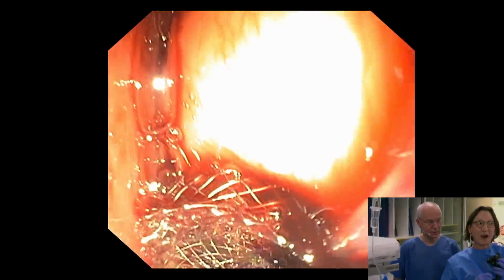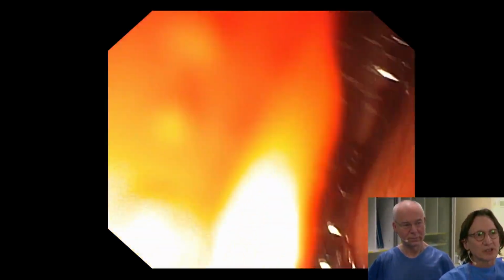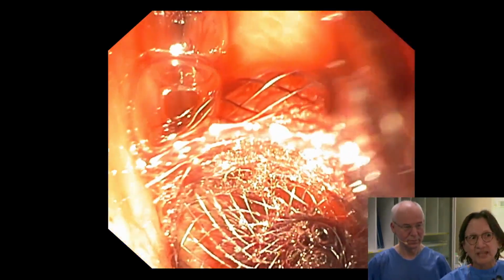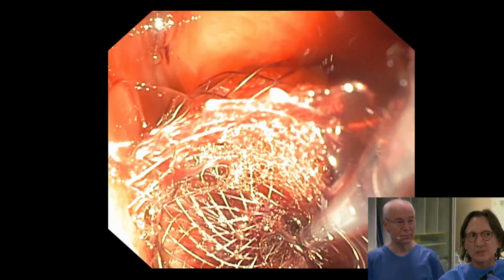So you do this procedure routinely without fluoroscopy? Always. I don't think I can remember the last time I had to use fluoroscopy. Now, that's very different from some of the other Axios procedures or drainage procedures. GEs, I always use fluoroscopy. Bile duct, I always use fluoroscopy. Gallbladder, all depends on whether I want to inject to see if the cystic duct is patent.